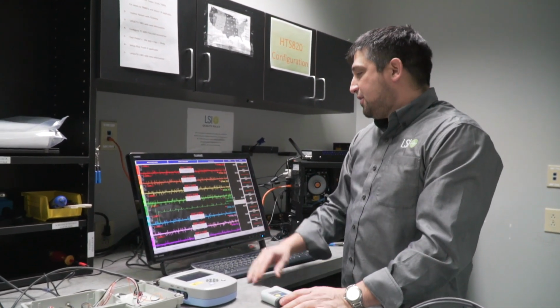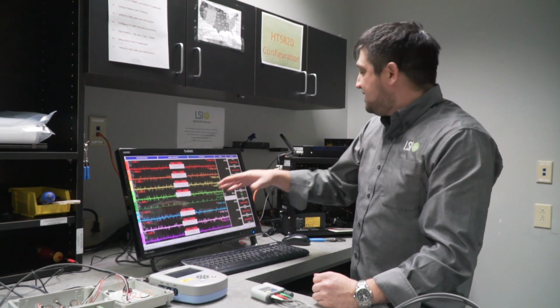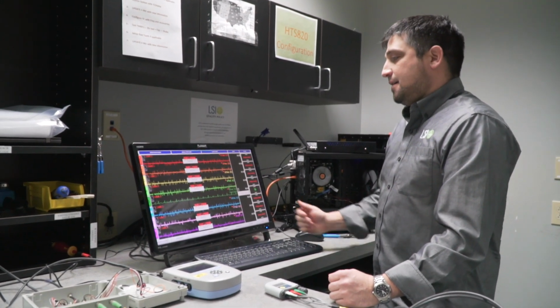You can see here I'm testing on channel 5. But the basic concept is we have our transmitter that transmits human heart rhythm, detects it, and transmits it out to our central station. Our central station relays that information back in and gives us a nice pretty signal.